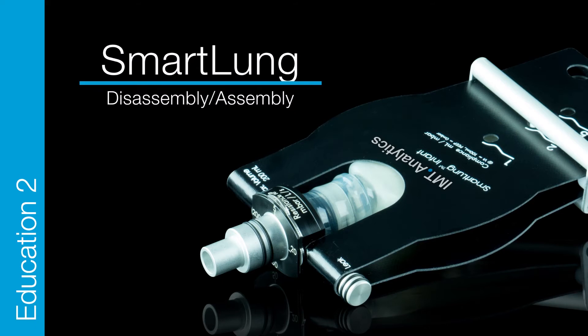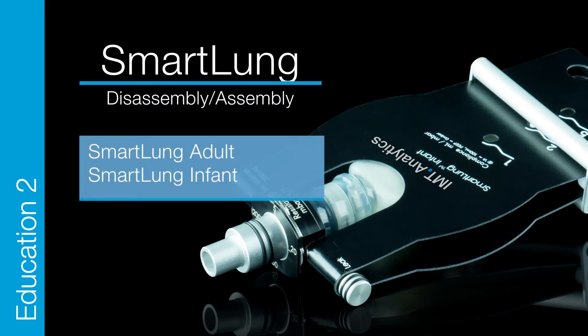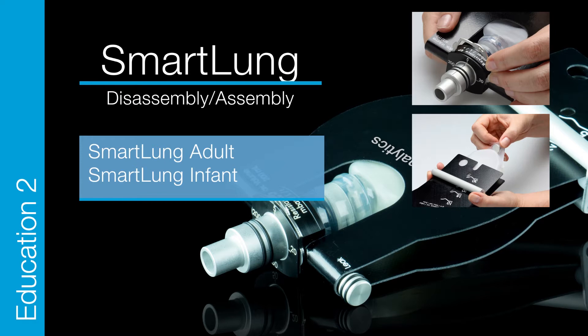Smart Lung Education 2. Disassembly and assembly of the Smart Lung adult and Smart Lung infant. Let's start.